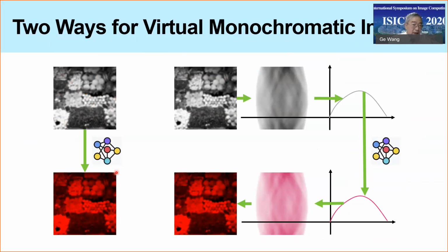And on the other hand, you have a dual energy CT counterpart, which gives you virtually monochromatic results. You can do machine learning, okay? So bring the imperfect, less accurate image to virtual monochromatic imaging acquired with dual energy CT. This is a method, and we implemented that method.